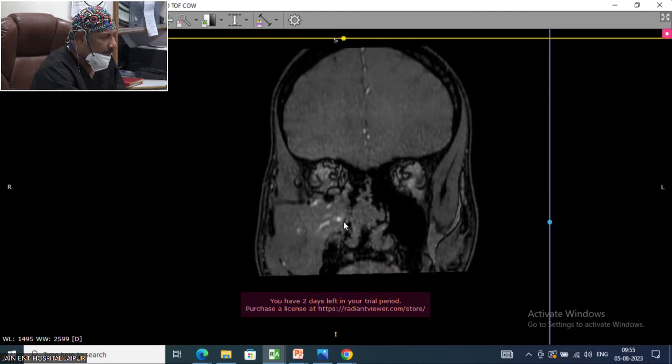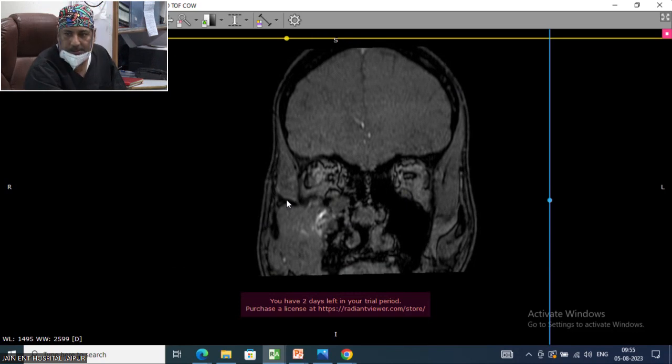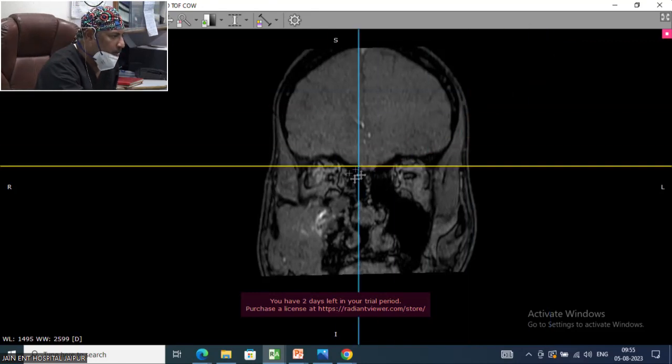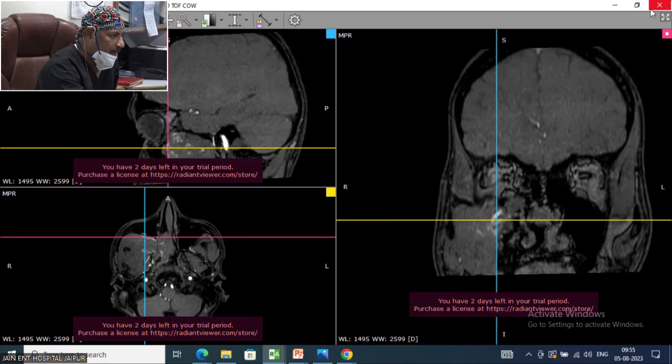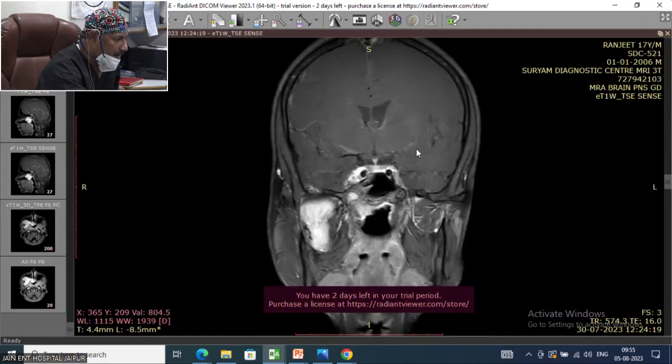Can you see? Yes. That is the maxillary artery, with the principal artery giving ramifications into the tumor to supply it all over. So that's how it makes your principle of endoscopic surgery. First, go behind and devascularize this tumor by taking this vessel, clamping this vessel, clipping this vessel, and then you can bring out this tumor. At no point of time you are supposed to go inside the tumor. No point of time. So our goal in this case, our plan is very simple.